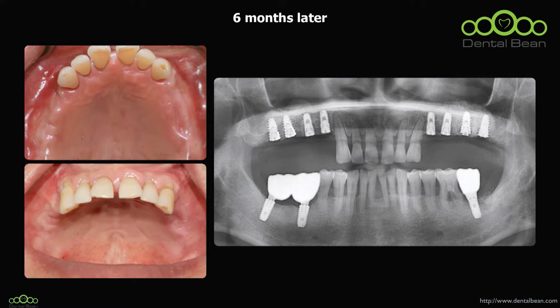And the implant site was well healed. The sinus bone graft was well done, I think. Like this, when the initial stability of the implant is very poor, and the bone quality is very poor, it's good to apply the temporary denture after applying the soft liner. And in today's case, I will deliver the temporary denture after applying the soft liner. And I really hope this time was very helpful and informative to your clinic.